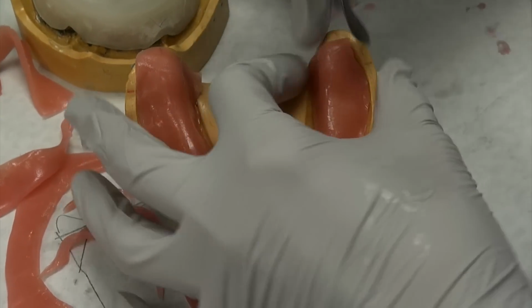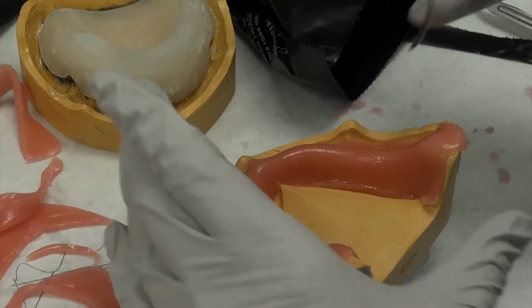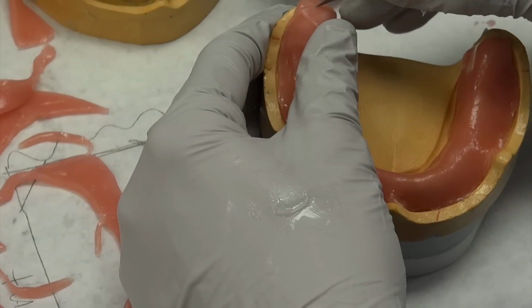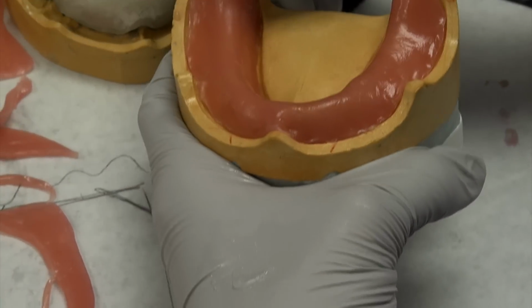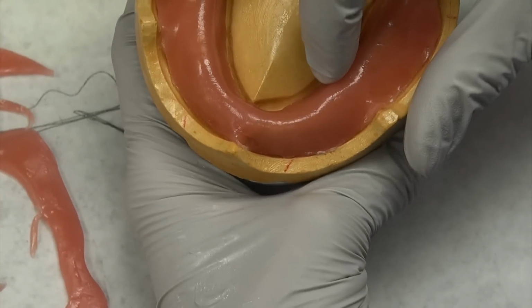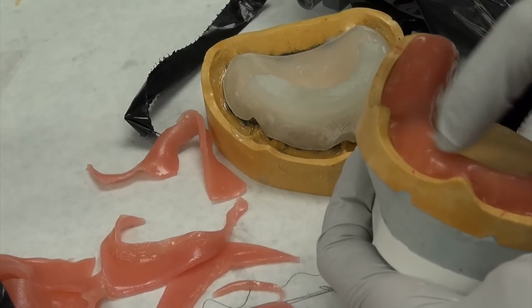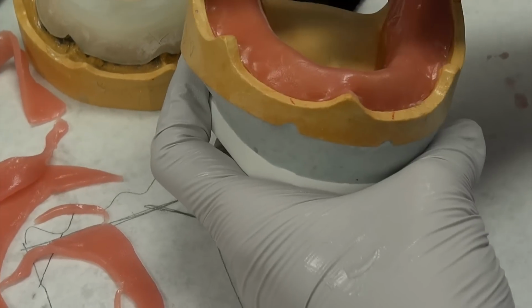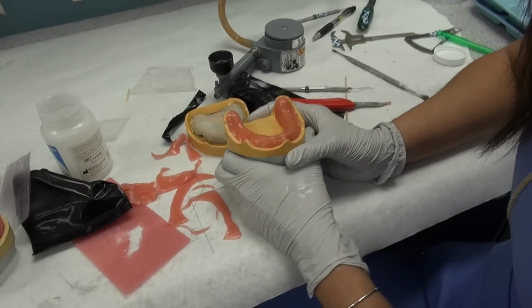Now the thing with the mandibular is we will actually be adding a piece of triad material to the lingual to make it a thickness of 3 to 3.5. So we want the retromolar pad to be about 2, the distal lingual to be about 2. We want the lingual sulcus area here to be about 3 to 3.5. We want the buccal shelf to be 2. And then in these areas, the lingual slope, the buccal slope as well as the labial slope and the crest, we want that to be 1 to 1.5. Please refer to your manuals for all of the exact dimensions.